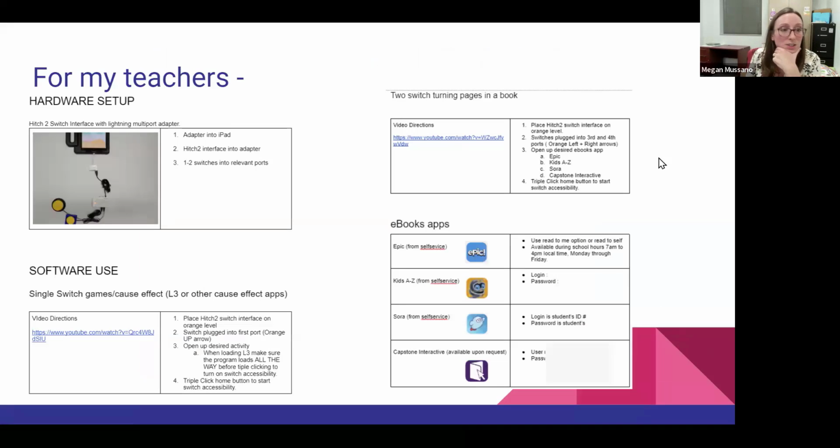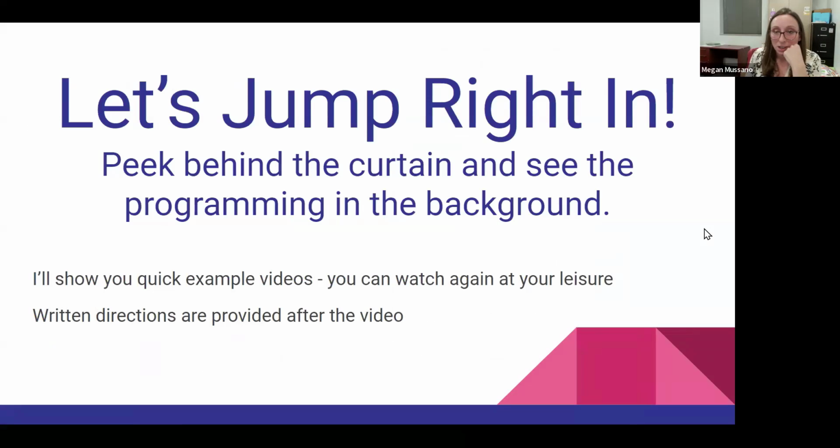So this is what I sent out to the teachers. I showed them a picture of the setup. Here's some single switch activities. That was my video, another video, and then a few different ways that they could do the books. And this handout was kind of all they needed, which was nice.